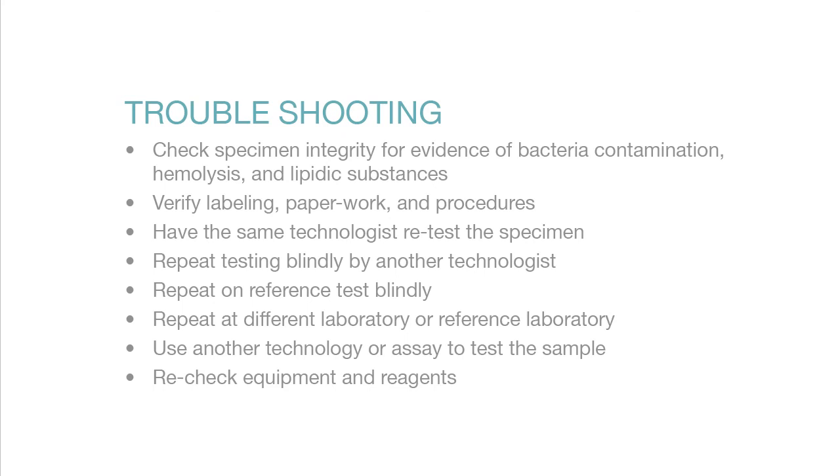If you encounter a problem with the test, please follow our troubleshooting guide. Check specimen integrity for evidence of bacterial contamination, hemolysis, and lipidic substances. Verify labeling, paperwork, and procedures. Have the same technologist retest the specimen, then repeat testing blindly by another technologist. Repeat on a reference test blindly, or at a different or reference laboratory. Use another technology or assay to test the sample, and recheck equipment and reagents.